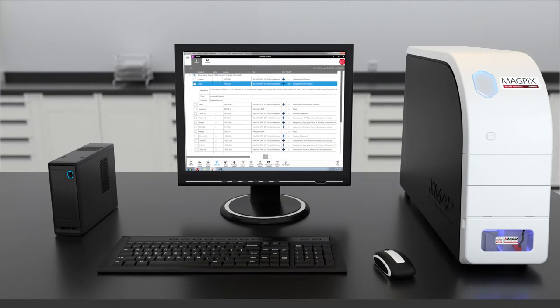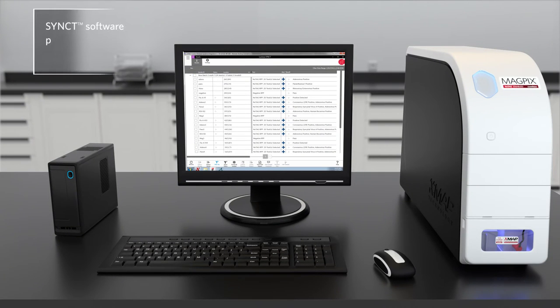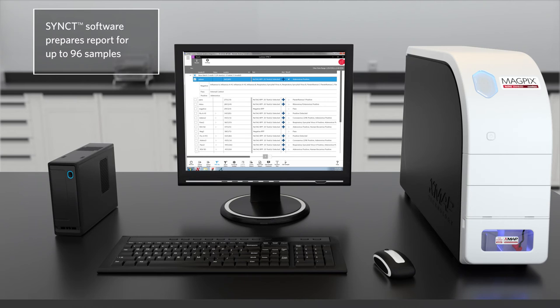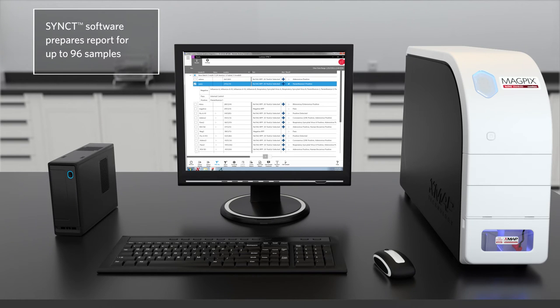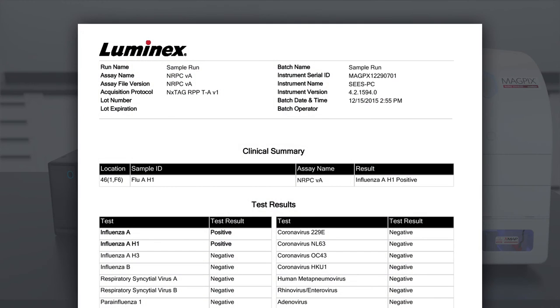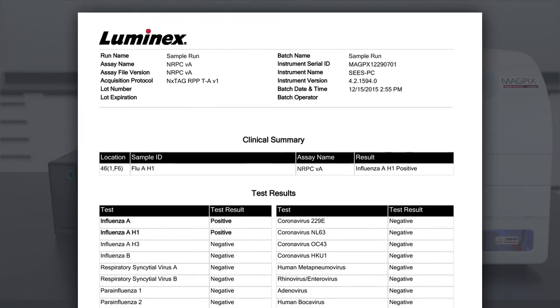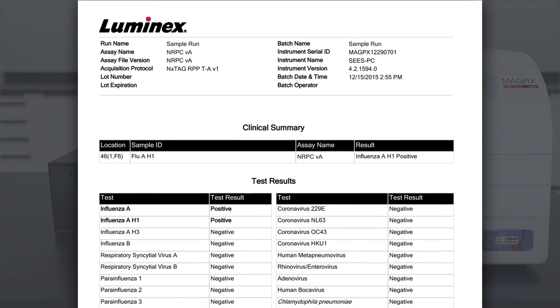At the end of the run, Luminex's synced software prepares the report for up to 96 samples or can focus on a single result. The reported pathogens can also be customized to the physician's order.